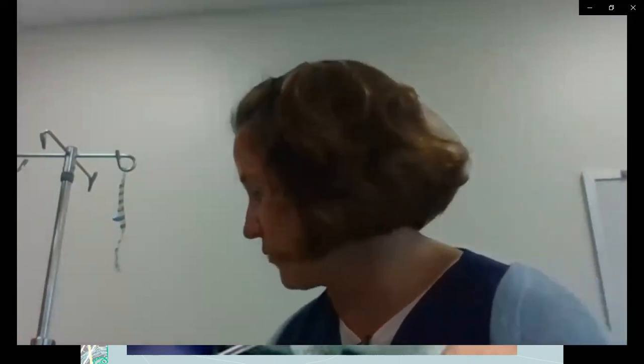Again, this is just going to be general muscle memory, going through the motions of the process. Not going through all the safeguards you would have that are medication specific. But remember, anytime you're administering any medication, including IV fluids, understand the implication, understand why they're getting it, know what the compatibility is if you're giving a primary and a secondary together, and know if they can mix together.